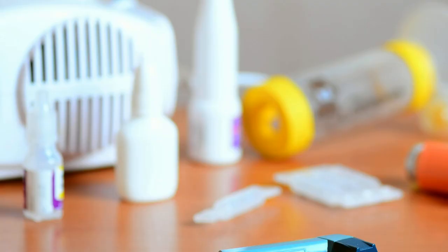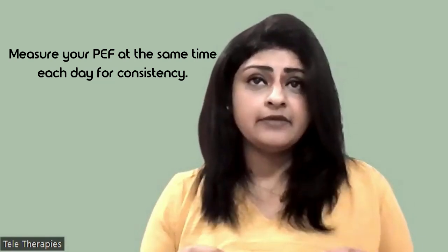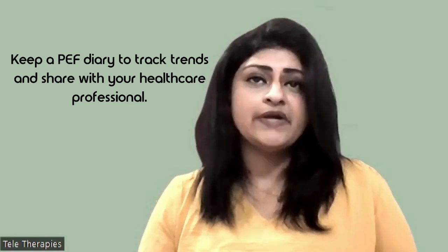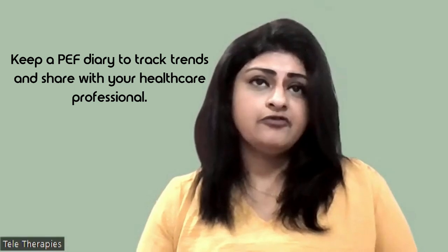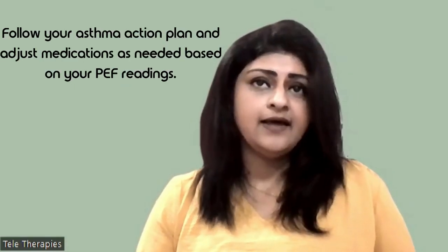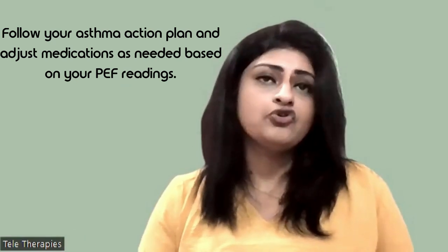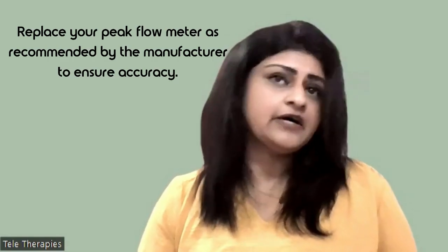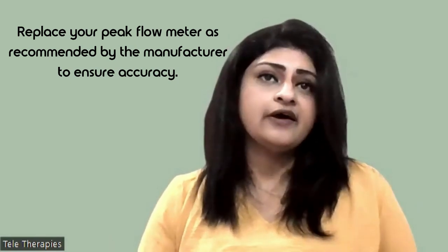Some tips for effective peak expiratory flow monitoring: measure your peak expiratory flow at the same time each day for consistency. Keep a peak expiratory flow diary to track trends and share it with your healthcare professional. Follow your asthma action plan and adjust medications as needed based on your readings. Replace your peak flow meter as recommended by the manufacturer's instructions to ensure accuracy. Monitoring your peak expiratory flow is a simple yet powerful tool.